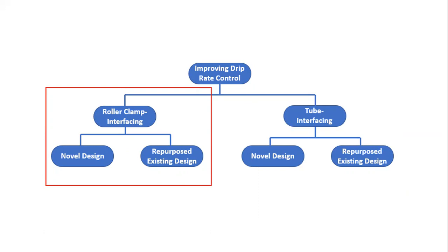This is actually where COVID-19 was a big factor, since it was important to keep in mind that if we wanted a more complex solution here, then it might just need to be modeled in CAD or computationally tested. Whereas if we used a more simple solution, then we could possibly physically test it.